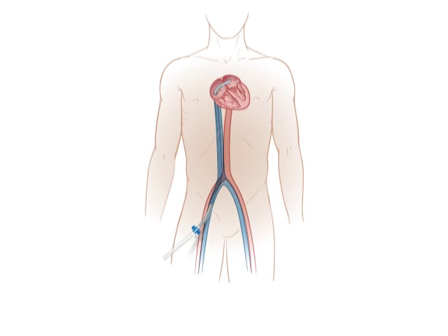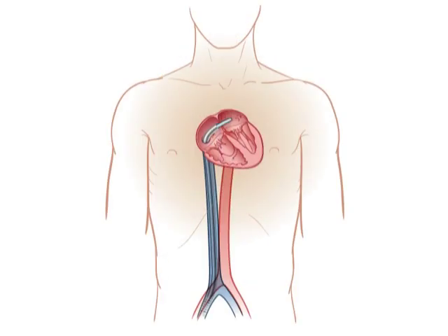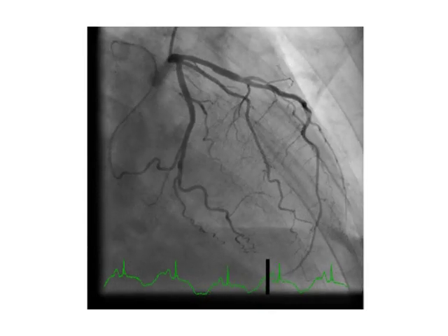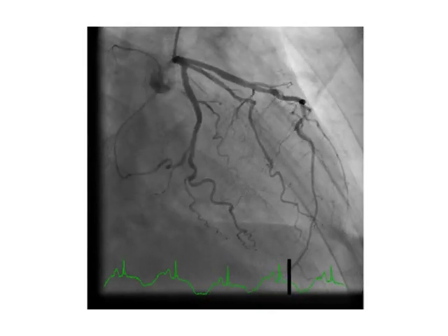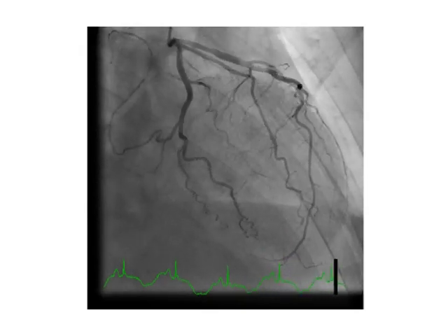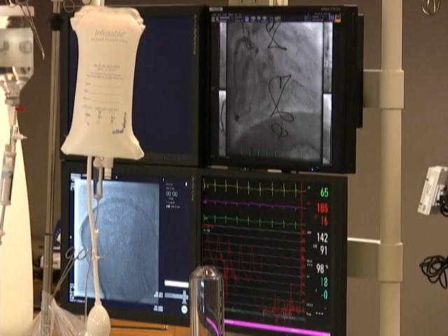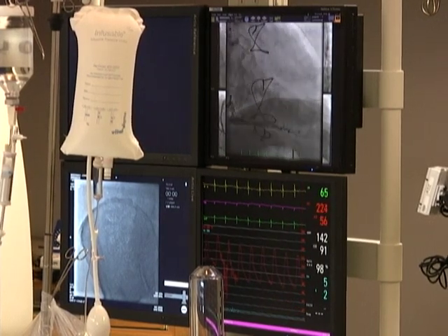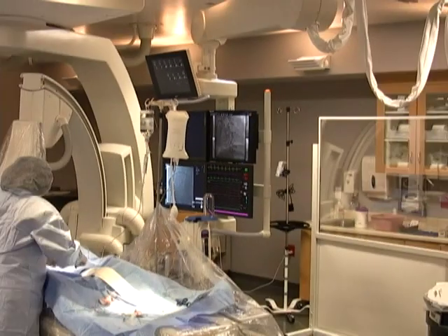The doctor will insert a short plastic sleeve called a sheath into a blood vessel. Then the catheter will be put into the sheath and threaded toward your heart. Depending on why you're having the procedure, the doctor might inject contrast dye through the catheter. If this happens, you'll feel some warmth for a few seconds. Images of your heart and arteries will appear on a monitor and guide your doctor, and the doctor might explain what he or she sees.